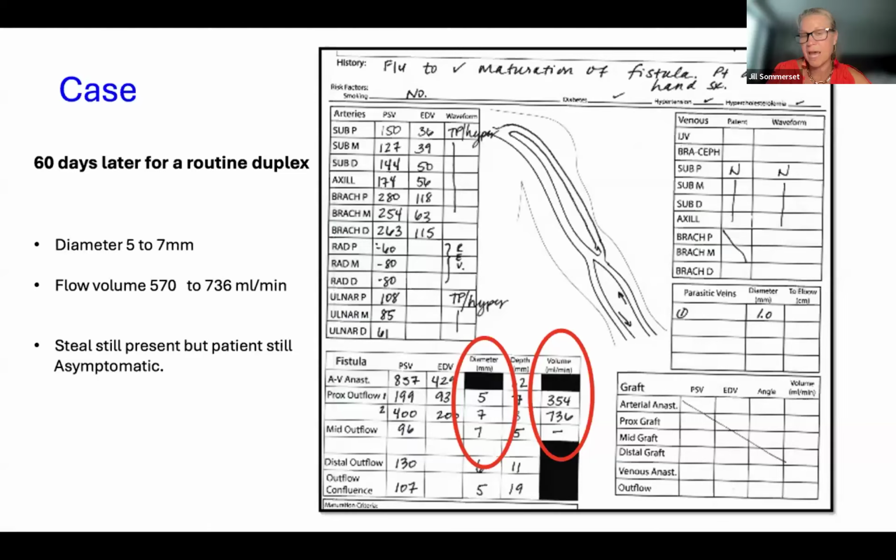So this would be a patient then, based on the ultrasound, we make decision making of when the patient is ready for dialysis. And it's important not to just stop at the mid outflow fistula. We have to follow it all the way up to the confluence of that cephalic into the subclavian vein. And then we follow the subclavian vein to ensure there is no central venous obstruction. So we watch these velocities as we follow it all the way to the central part of the chest.